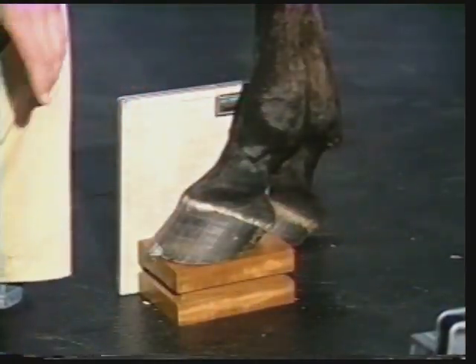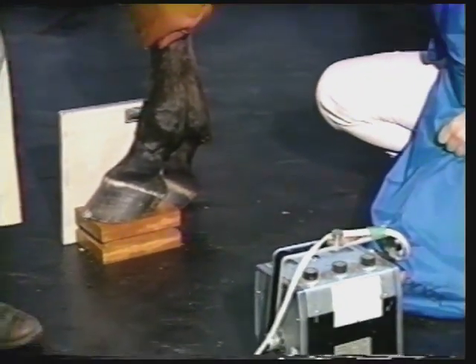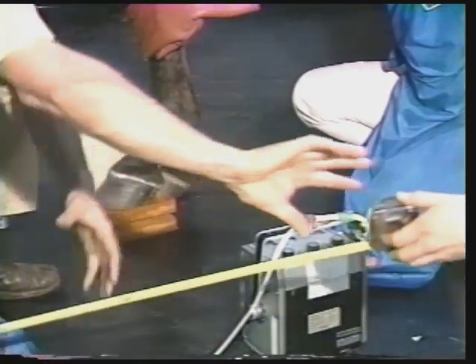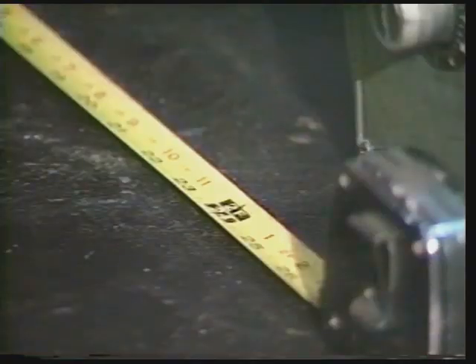Myself, my assistant, and the handler will wear a lead apron. The assistant will wear a lead glove. No one will be standing in a direct beam. Anyone in the room that is not taking radiographs or concerned with the procedure must stand at least 12 feet from behind and from the machine. It's quite easy for us to overcome the hazards of radiation if we just adhere to the safety standards that are being given today.